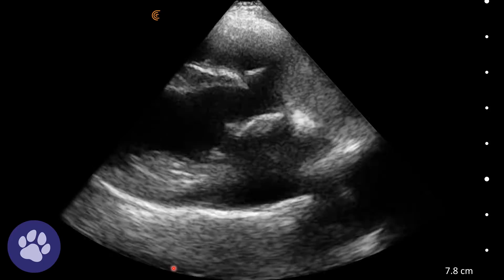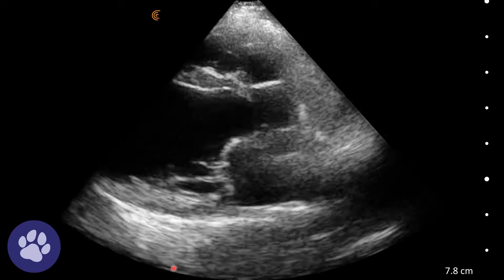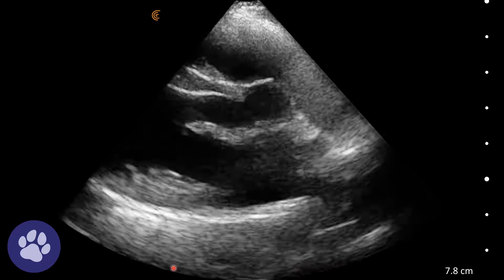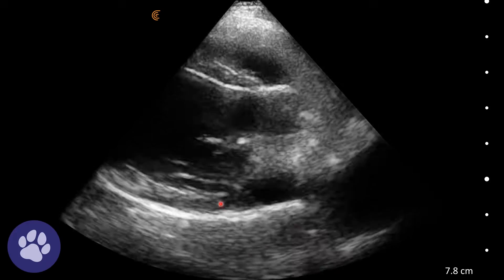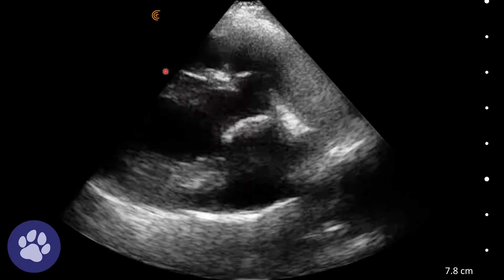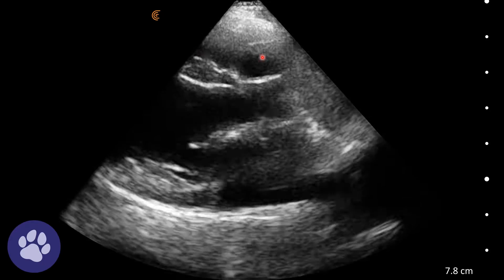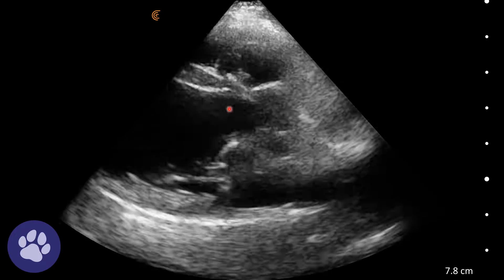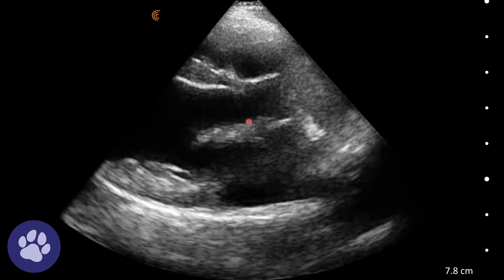We've now rotated the probe slightly so we've still got a right parasternal long axis view, but this is a five chamber view. We've still got the left atrium here, the mitral valves opening and closing, the left ventricle here, and the right side of the heart up here, but we've also got the aortic outflow tract with the aortic valves opening and closing here.